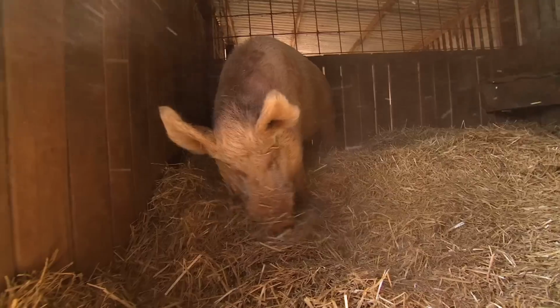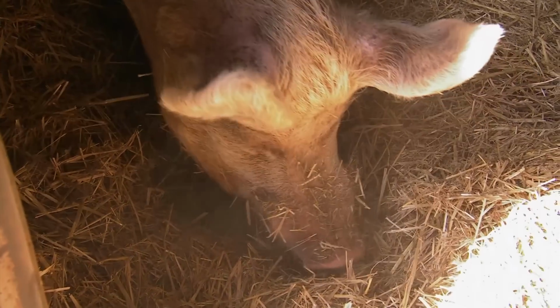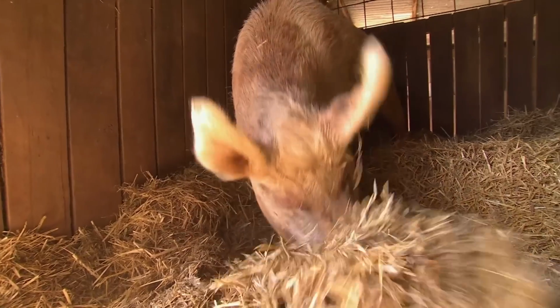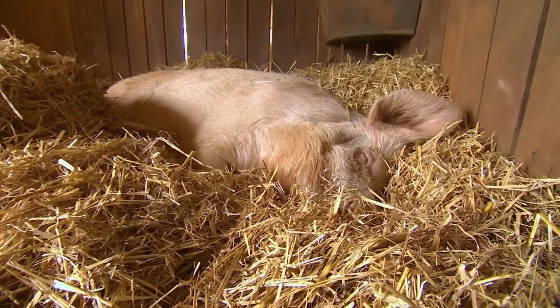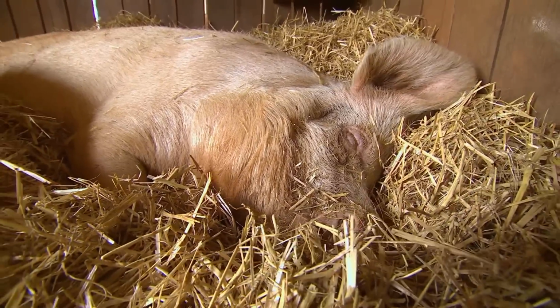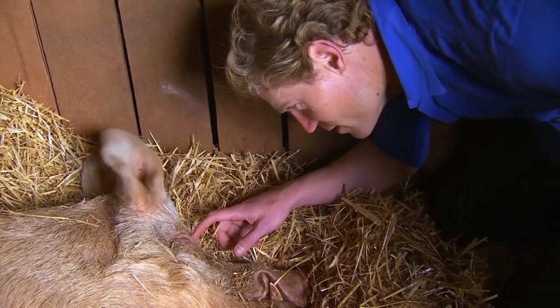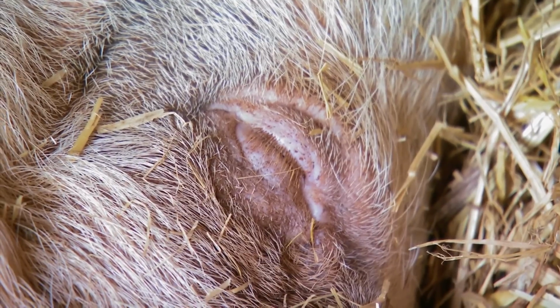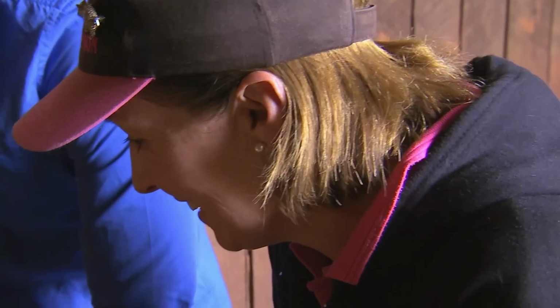Just arranging the bed. So the plan is to get in there with the wire, being very careful that he is going to stay asleep, and then start to shave those tusks away. It's incredibly dangerous, so we just have to make sure he is really and truly asleep. Hey, how you doing? You out to it? Yeah, you're asleep enough. At Edgar's mission, Burpy is now asleep, and Chris is happy to start removing his dangerous tusks. So this is the one we've got to cut here.